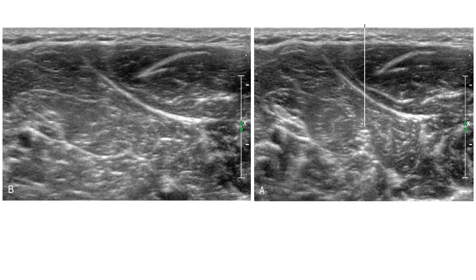The nerve can hide among the surrounding structures. With small structures such as a tendon or nerve, this can make a big difference — the difference between the structure being seen or not seen at all. As you can see in the second image, the median nerve is appreciated after being invisible in the first image. Just tilting the probe made this big difference.